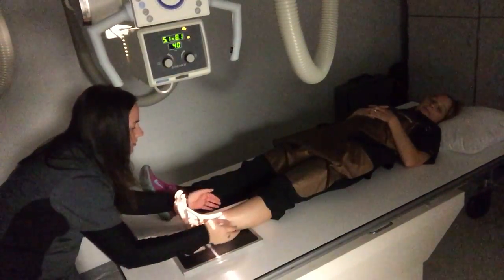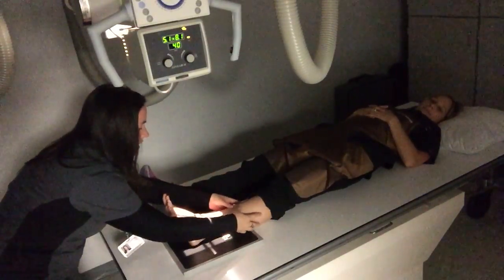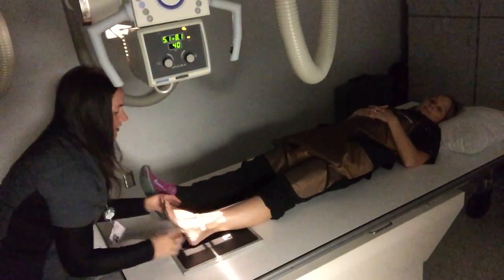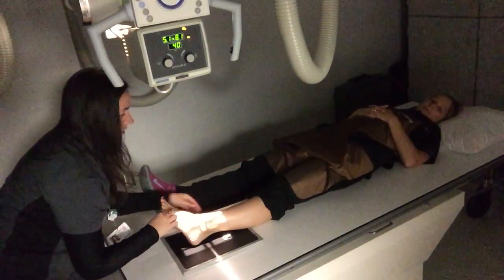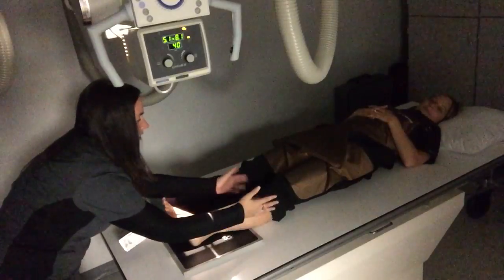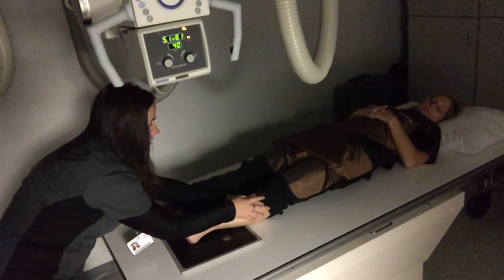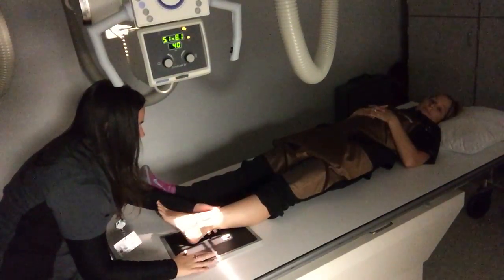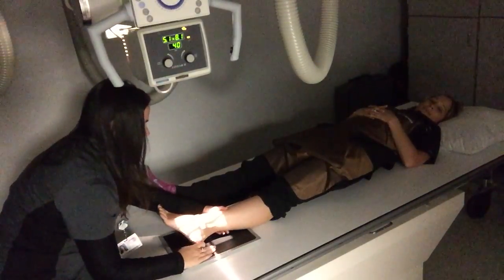This is a medial oblique, so I'm going to rotate her leg medially, which means I'm going to turn her toes in. And I'm going to rotate her whole leg. I'm not just going to turn her foot, because turning her foot is going to give me a real distorted view of these bones coming into her ankle as well. So I really want to roll my patient at their knee for this. I'm turning her 45 degrees that direction. And then I'm going to slide my board underneath of her so I have her right in the middle again.